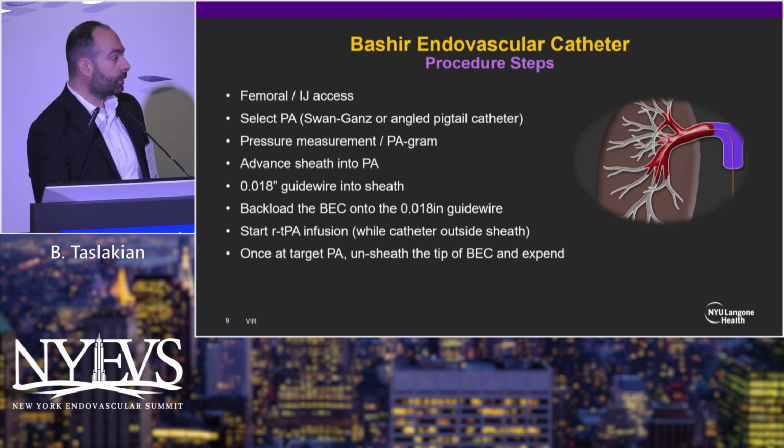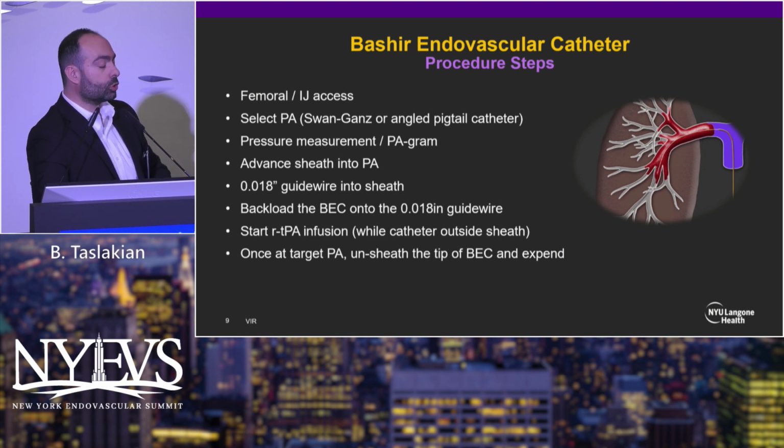You can do it through a femoral or IJ access as any other PE intervention. In general, when I do thrombolysis, I go IJ, but I was one of the investigators in the trial, so I was doing bilateral femoral access.